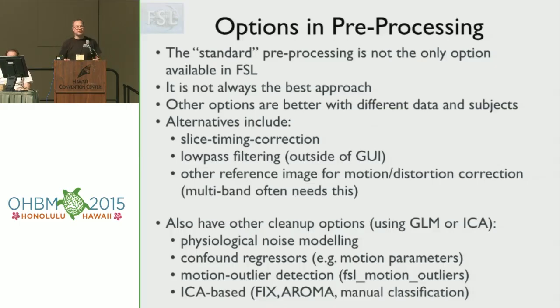Low pass filtering is an option. It's not an easy option in that it's not a button that you just click, but there's a command line tool that you can run, and then you can feed your data back into your analysis.